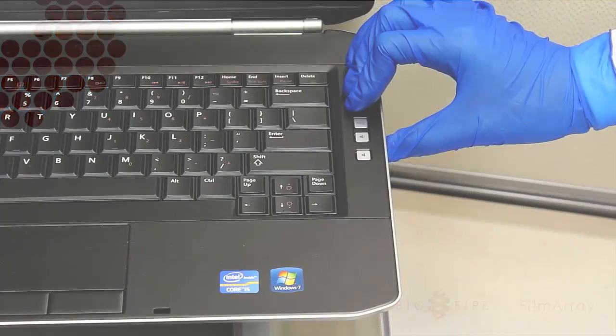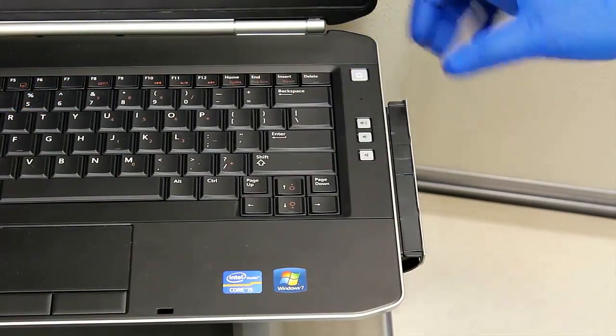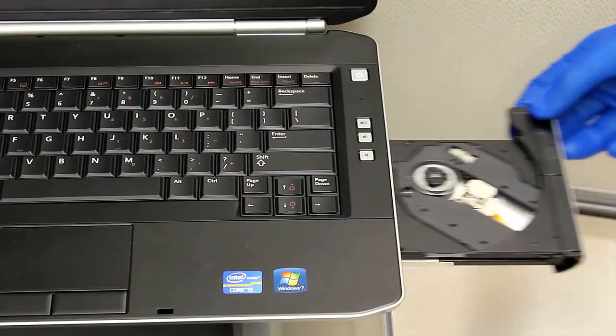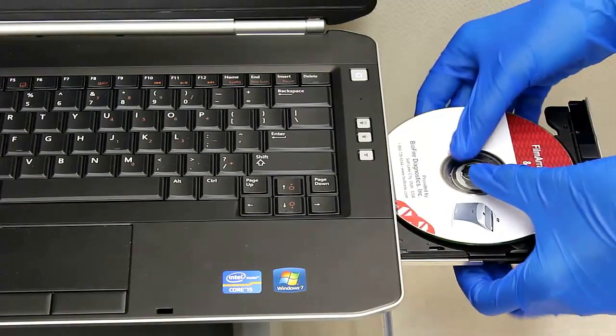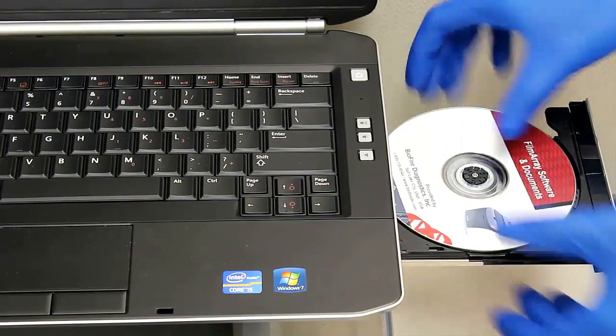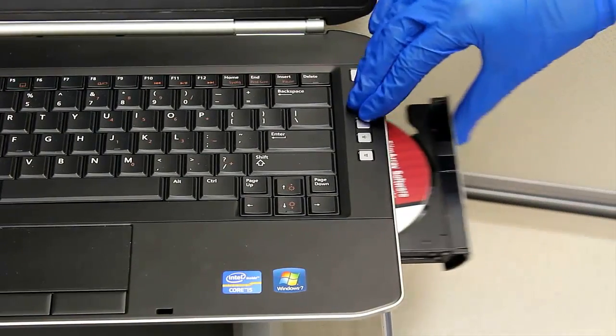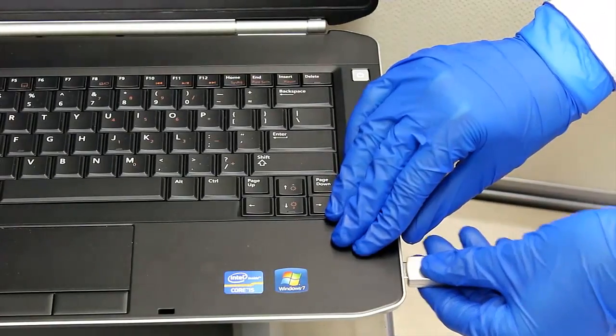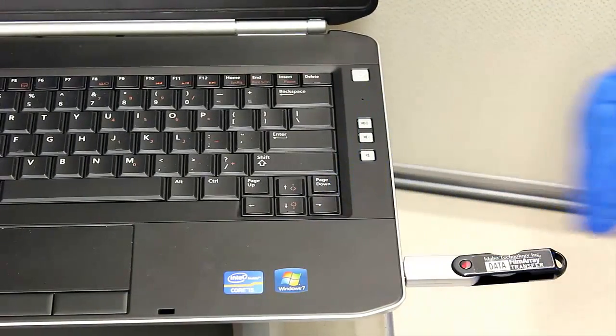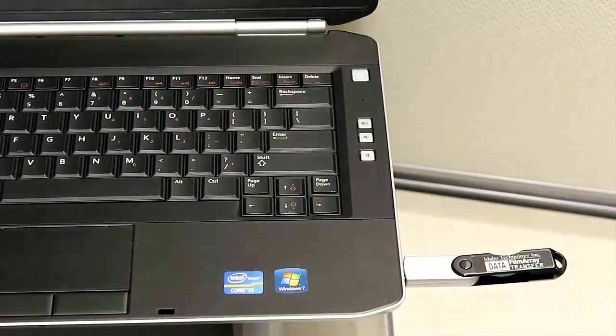A software pouch module can be loaded onto the FilmArray laptop from either a CD or from a flash drive. The first step is to insert the CD into the CD drive or insert the flash drive into a USB port.